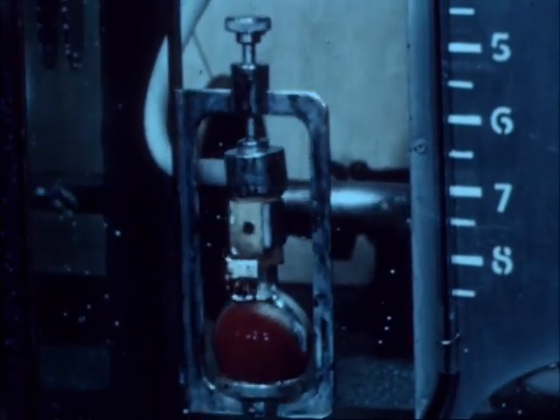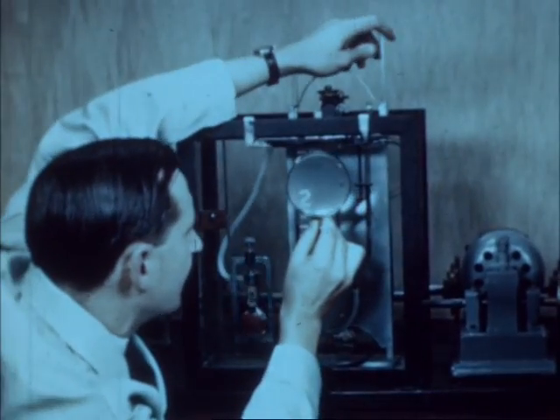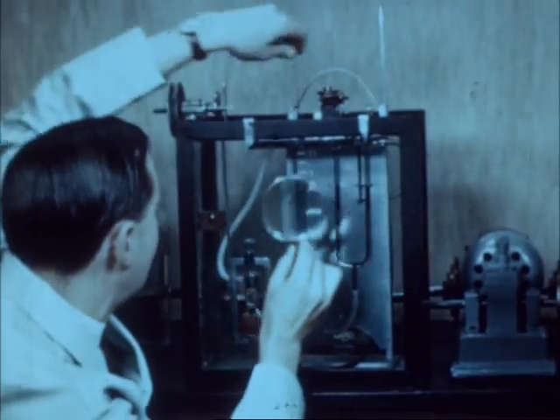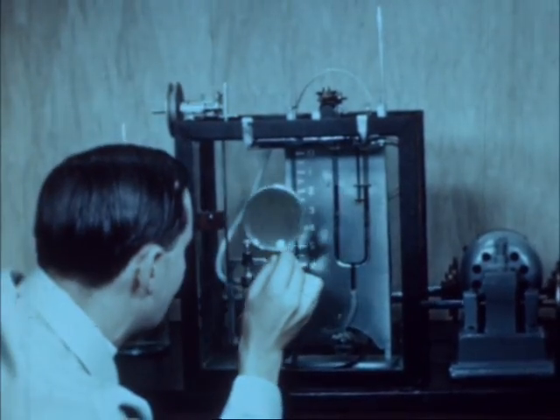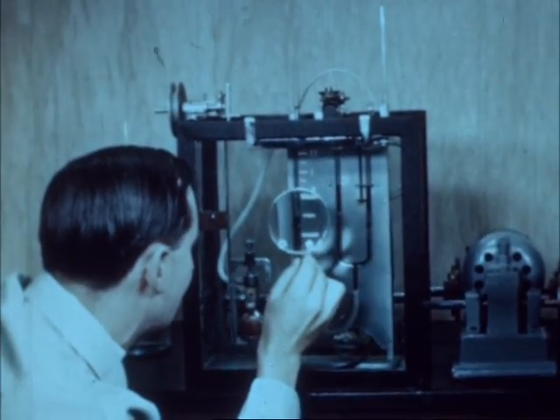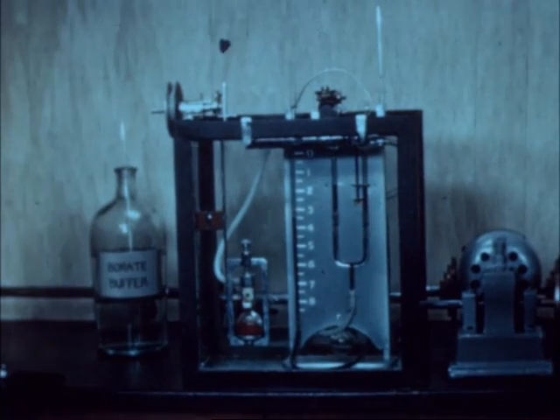Leveling tubes then adjust the pressure conditions to atmospheric, and the final reading of 0.350 cubic centimeters indicates that this 3 cubic centimeter sample of right heart blood had absorbed 0.500 minus 0.350, that is 0.150 cubic centimeters of oxygen. When an arterial sample has been similarly analyzed, we can calculate the cardiac output.